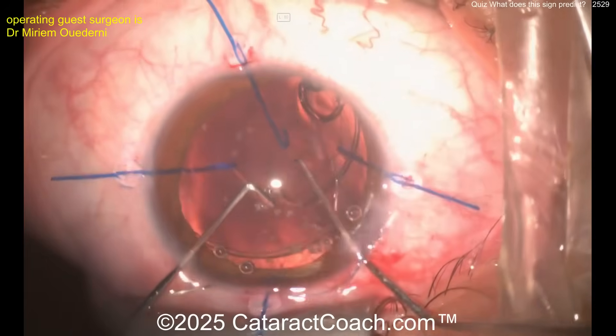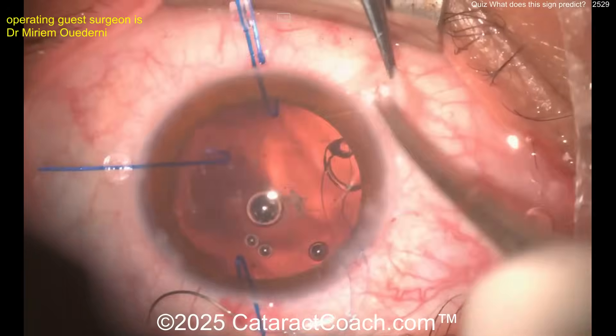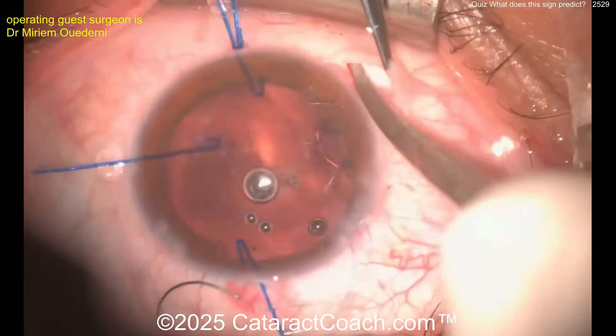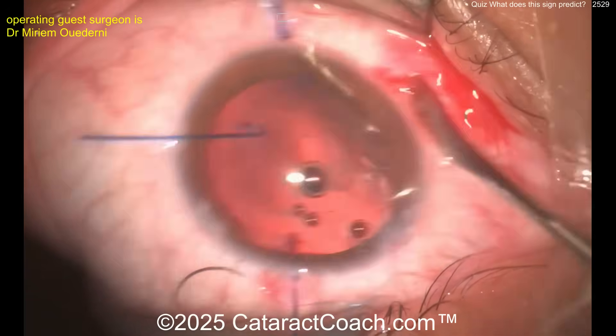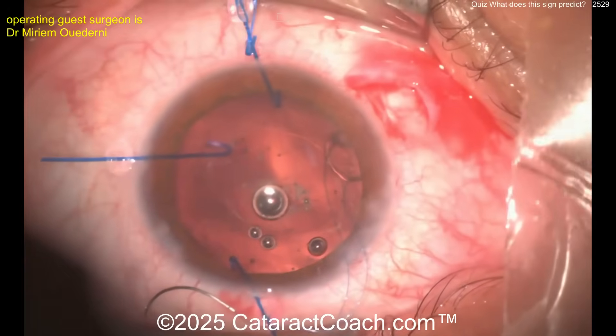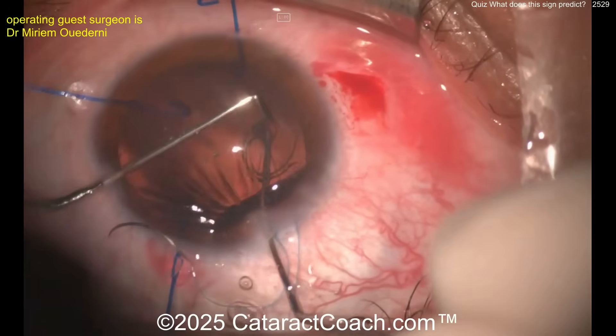How do you know where to place the eyelet for the Cionni ring? Well, you have to estimate where the weak support is. Now making a little peritomy and cleaning up the sclera — perhaps making a little groove here. Let's see what's going to happen next.